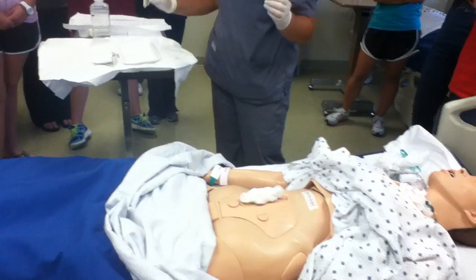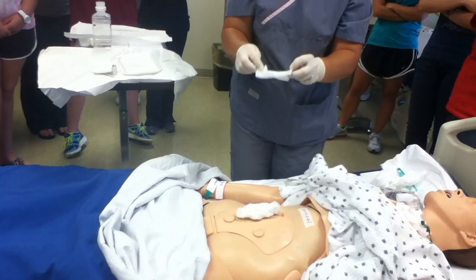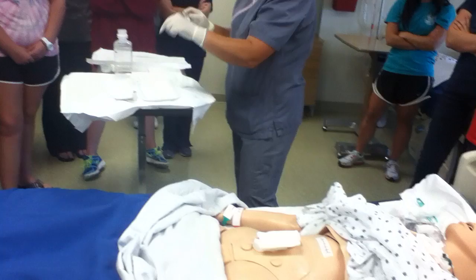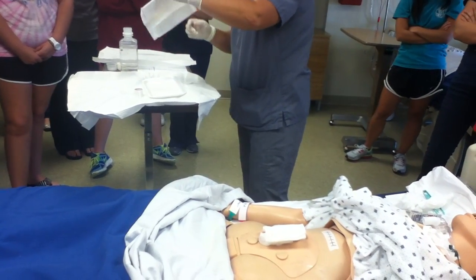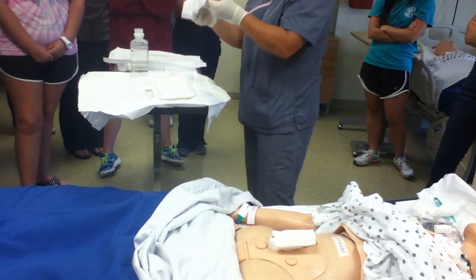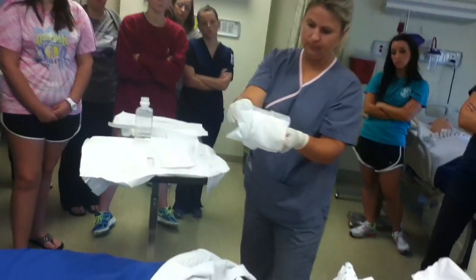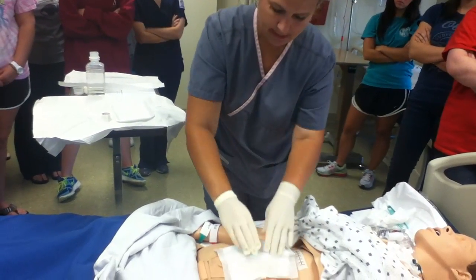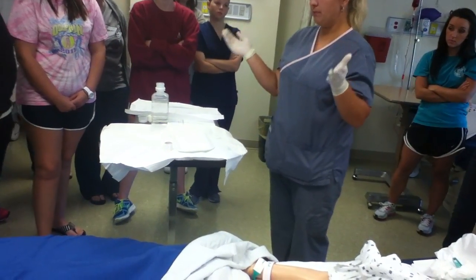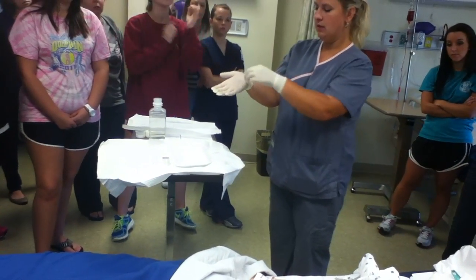Okay, the next thing I'm going to do is I'm going to cover the wound with a clean, dry 4x4, like so. And then the next thing I'm going to do is cover it with my ABD. Now, the ABD pad, the blue goes, are these smaller ABDs? Looks like it. The blue goes to the outside. I can drop it like this, and there we go. Now my sterile part of this procedure is actually over. I can now remove my sterile gloves.